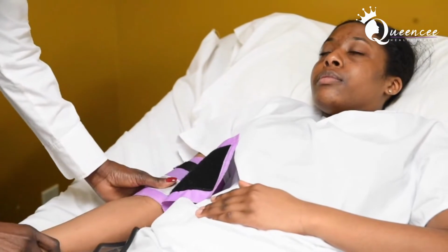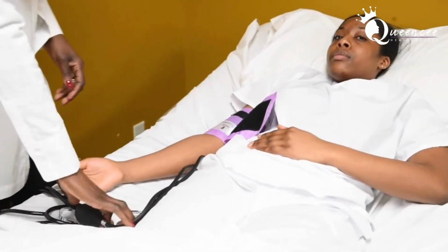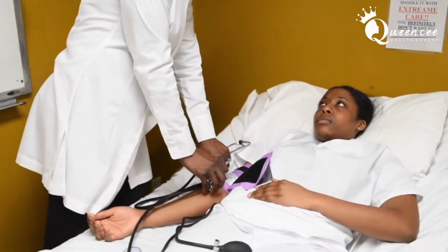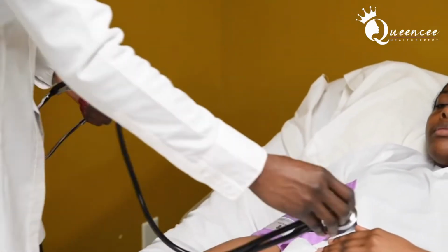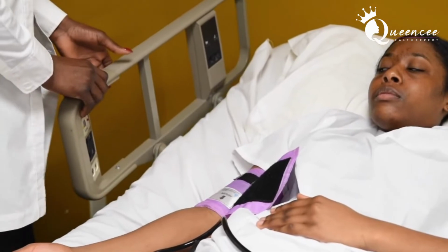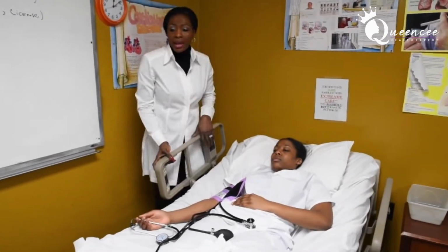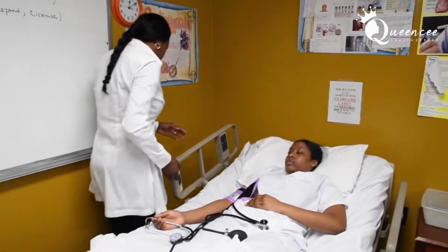Okay, you rest the patient's arm on the mattress. We said this part is what's going in contact with the brachial artery, so certainly you do not want to cover the brachial artery. Another thing that I would advise you to do, especially when it comes to blood pressure, we do not want to get this wrong, okay? We did not come this far to fail our CNA exam.